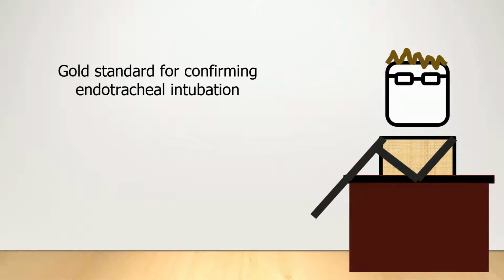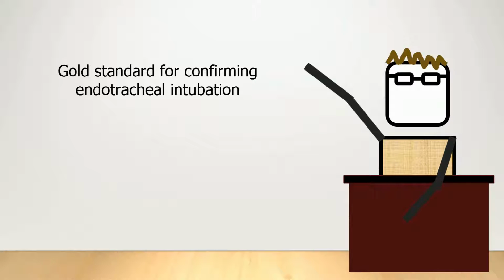not. If the tube is in the hypopharynx, you may get a signal, but it will become erratic as the tube starts moving around as you're starting to transport the patient. Even if the tube is in the stomach, you may read an initial capnograph, but this will fade away after a few breaths.